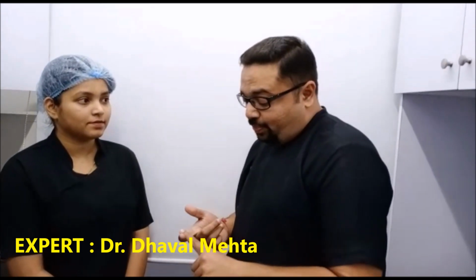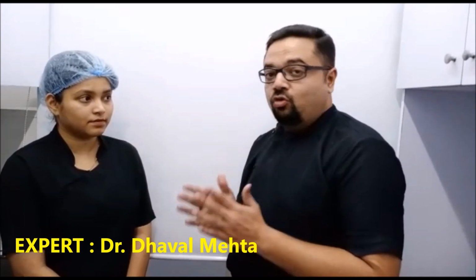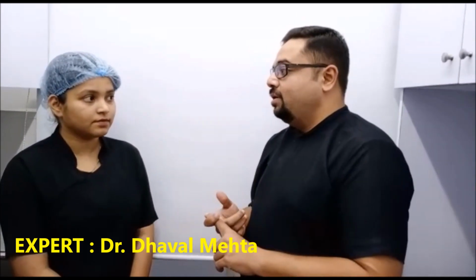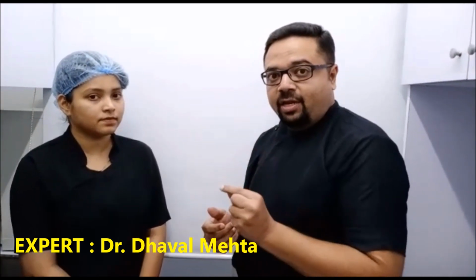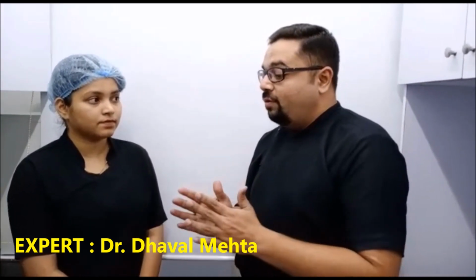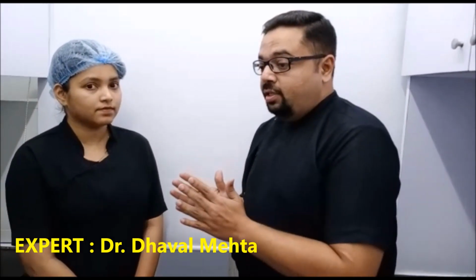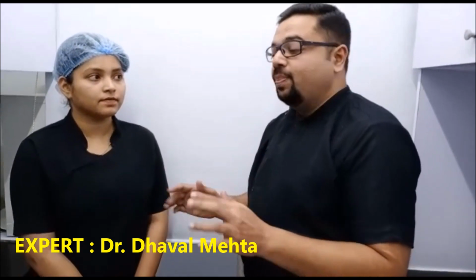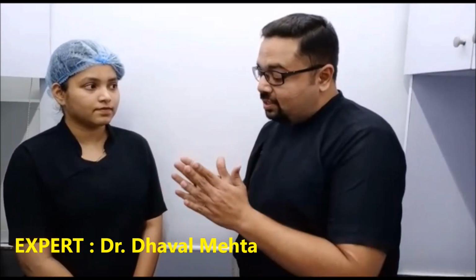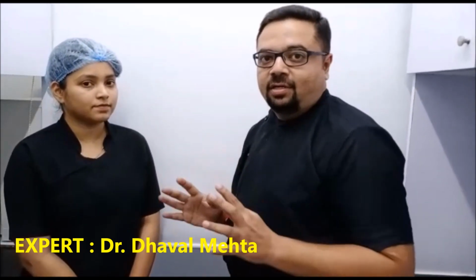In today's case, one more thing I would like to add. There was a distance of less than 2 mm. Still I grafted the site, because the thickness of the remaining buccal wall is also important. If you have a sound buccal bone, meaning more than 1 mm thick, then you can take a chance and avoid the graft even with a 2 mm distance. But when there is a thin buccal plate, then even if there is only a 1 mm gap, it is always better to graft the site. Clear?